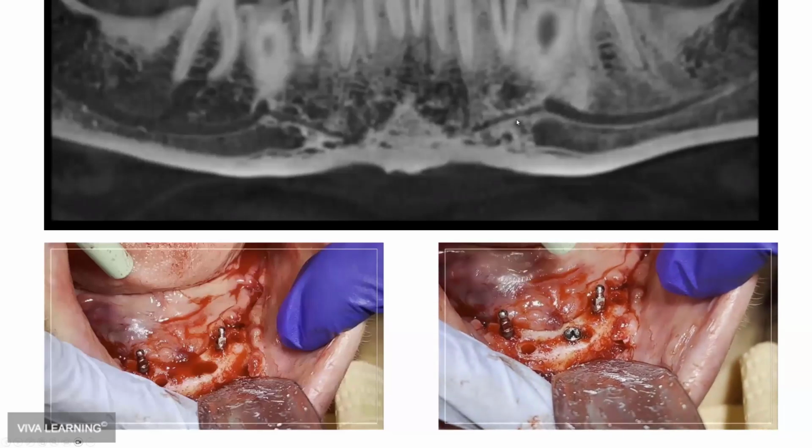The sensory innervation that it innervates is the anterior teeth. And in most every case you're going to be coming anywhere near this thing, there won't be any teeth left, as pictured.